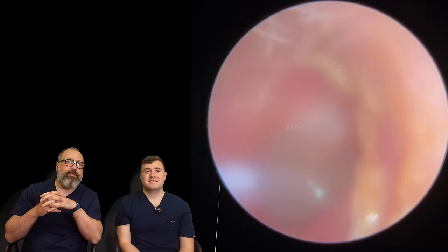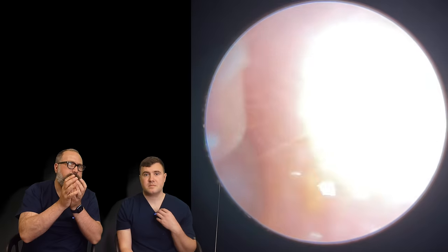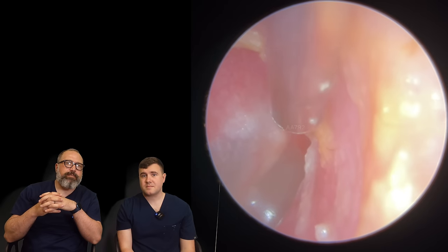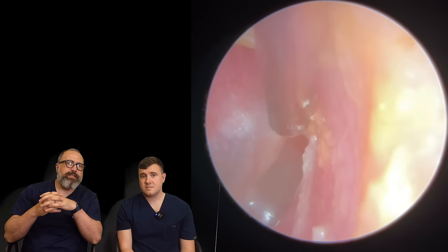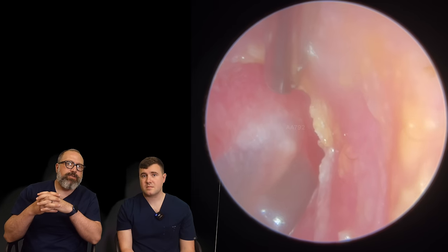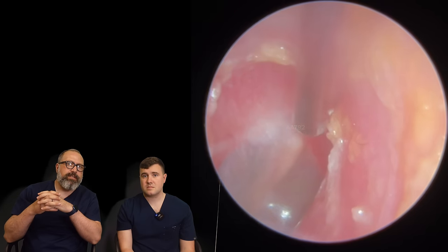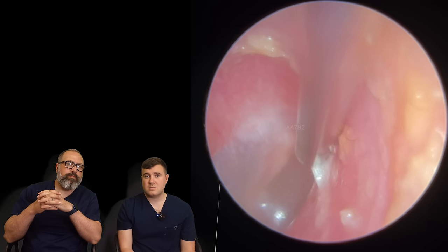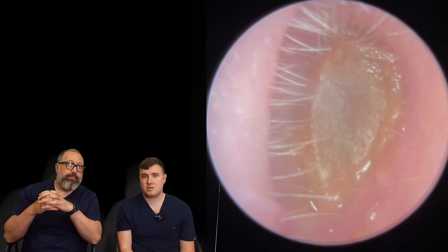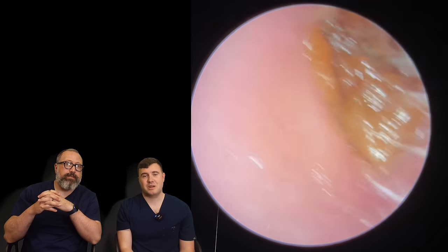You can see a very humid ear canal there as well. You'll find this a lot with these bigger plugs where they've sealed the ear canal up — you just don't get the moisture coming out. So just tidying up — you can see a little bit of a wetter section here. This tends to happen when patients have had baths or showers, a bit of water trapped by the side of that plug, just softening some of the skin. So this is the fine end, just tidying up a little bit. Looks nice and healthy, otherwise a little bit of irritation there. That's more than likely where that plug has just been in there for quite a while.